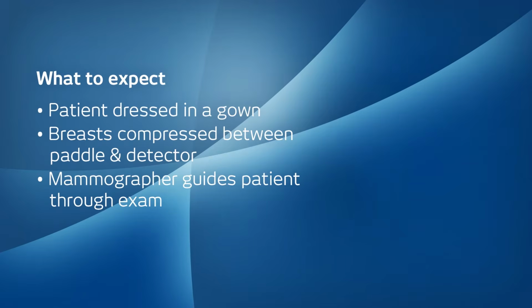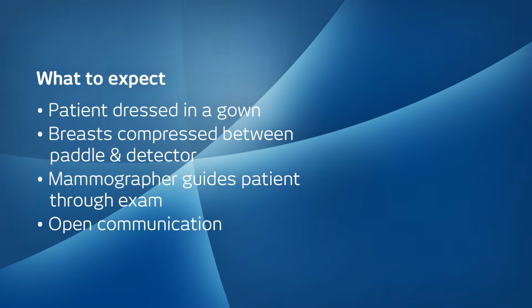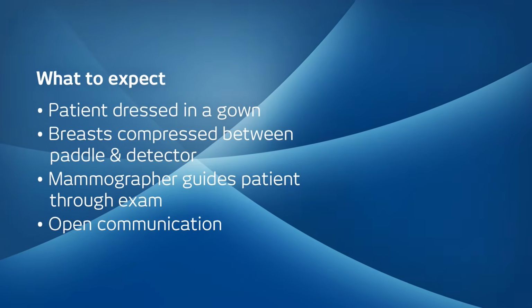The most important thing for the procedure is for the mammographer and the patient to both have open, flowing communication. That's probably the biggest key factor in a successful mammogram procedure for both patient comfort and their resultant images.